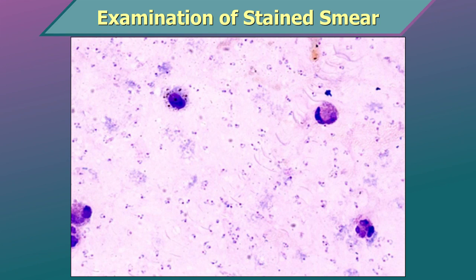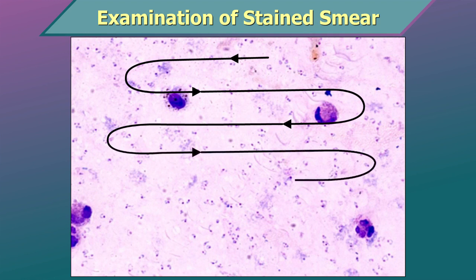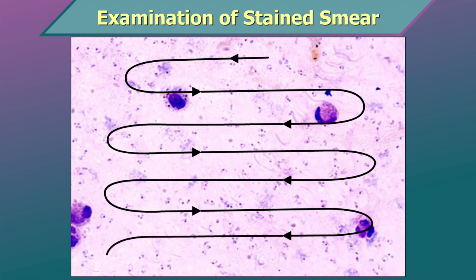Examine the blood film by moving along the edge of thick smear, then moving the slide inwards by one field, returning in a lateral movement, and so on. An area where 10 to 20 WBCs per field are seen in a thick smear is ideal for parasite detection. Examine a minimum of 100 fields in a thick film before declaring it negative.